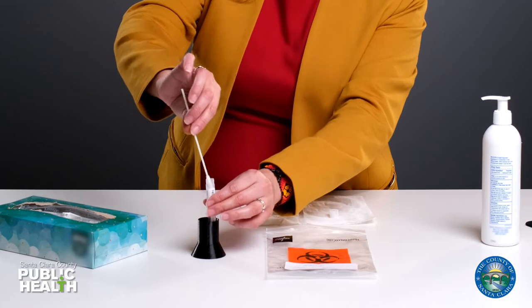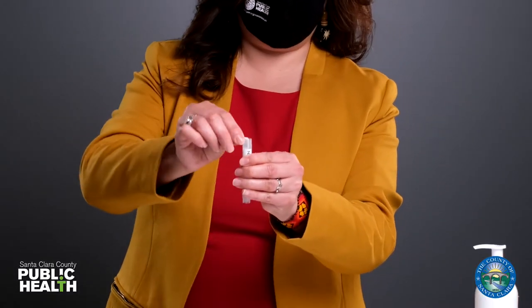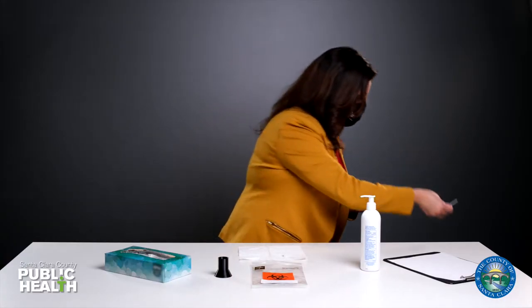Place the swab inside the test tube. Break off the stick and throw the rest of the stick into the trash.